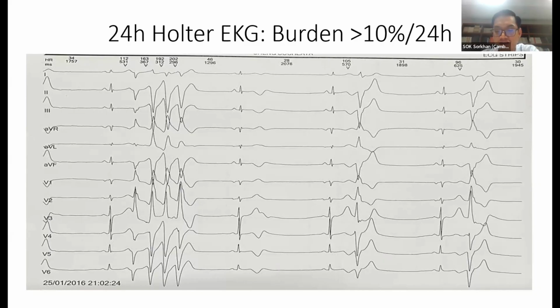So in this case, I discussed with Dr. Chun Hong, and we tried to do ablation first and wait and see. We explained to the patient about the ablation, but unfortunately, we didn't have a 3D mapping technician at that time. So we did it under fluoroscopy for this challenging case. So I will show you back here.